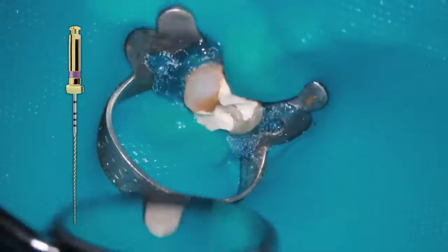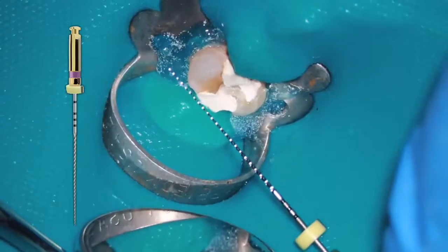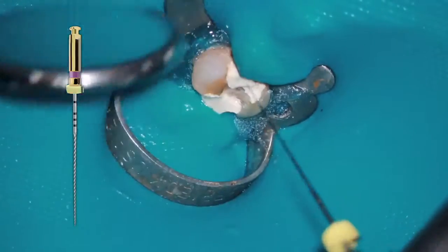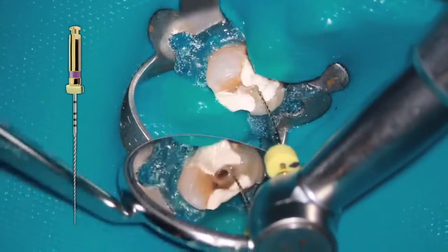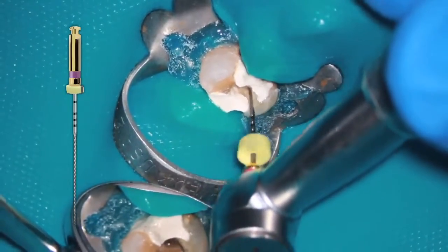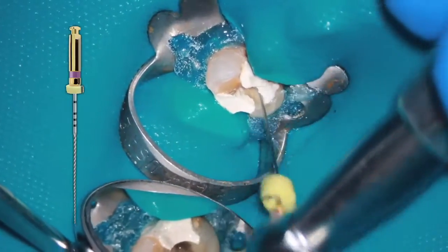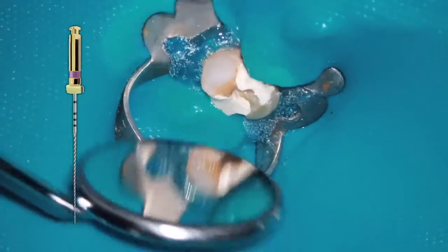Excellent. And we always wipe our instruments with alcohol. This cleans the flutes, also then evaporates so that we can see the condition of our metallurgy. They'll check for elongation or unwinding. And very gently, as I said, we've now instrumented this as 2 separate systems coronally. So right now I'm going to very gently use the same instrument in the other side and confirm the same outcome, a good glide path. As you can see, there was some debris coming coronal.